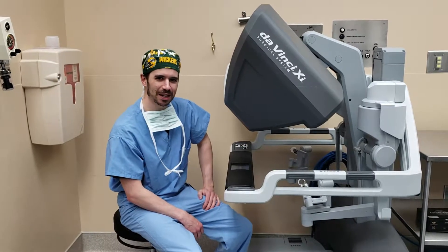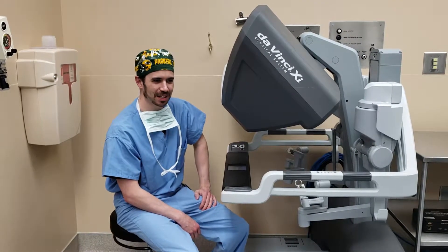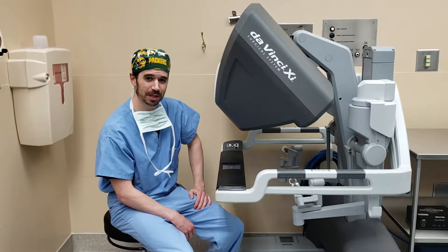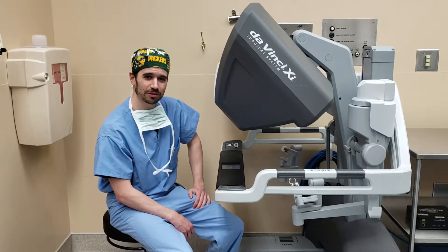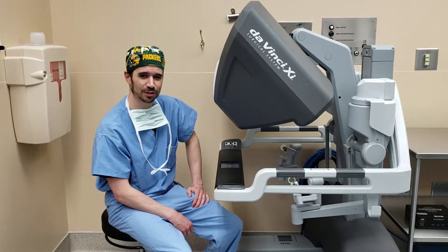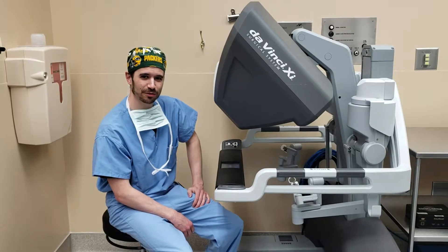Hey guys, we're working here with the robot today. This has got some new technology with the staplers that we're excited to try out. This should be good for our bariatric patients. We already use the robot for a lot of our surgical cases — I like using it for hernia procedures — but having this new advanced stapler is something we're looking forward to having.